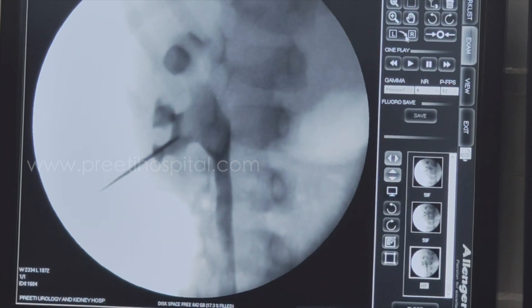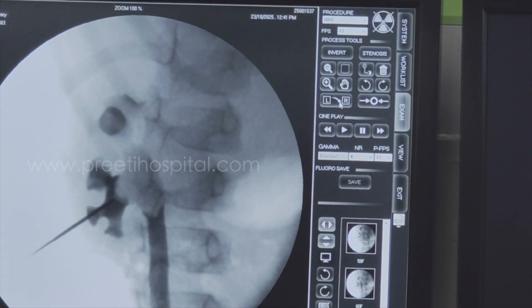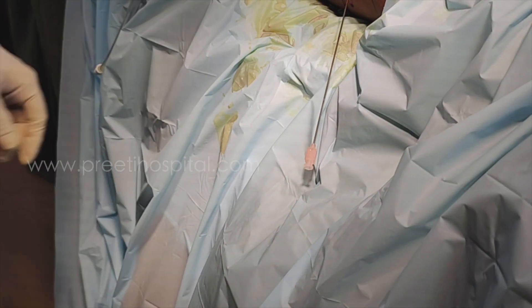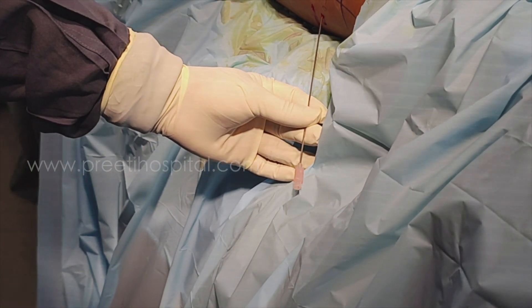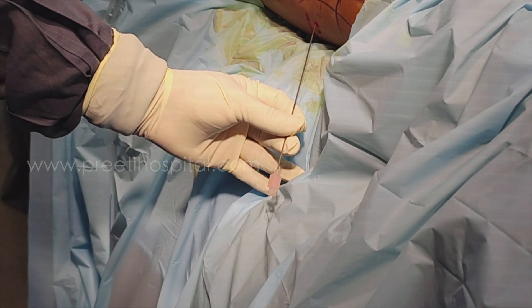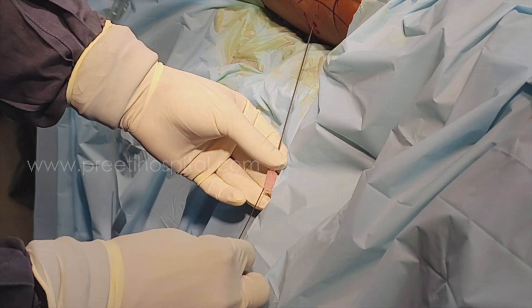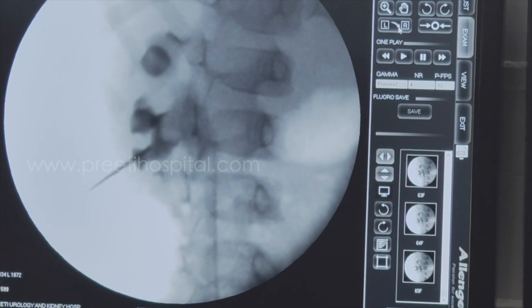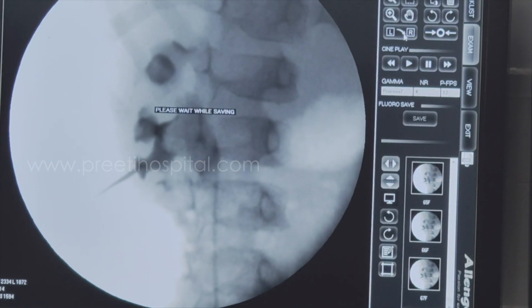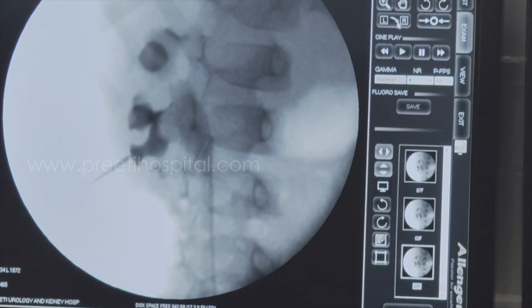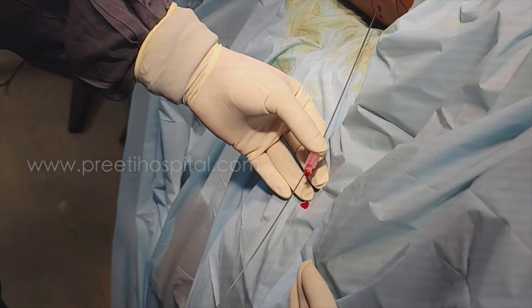Because anyway you have punctured, it is not going. I will come back a little bit — every time I am withdrawing it is not coming. I will withdraw a little bit again. It is coming — a little bloody because I have come out. So I will again ask him to inject saline. If you don't give resistance it will go deeper, but you should always come back and get to the periphery. Now inject saline. I will take it out and see whether the guidewire will go or not. You should not be in a hurry.